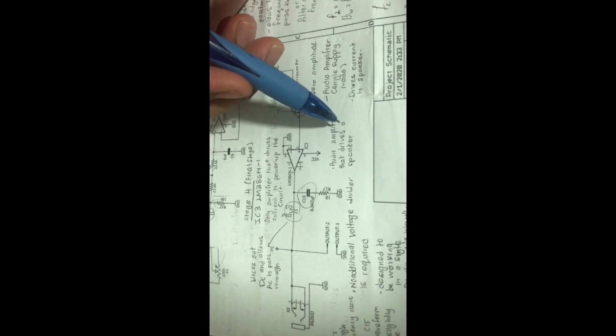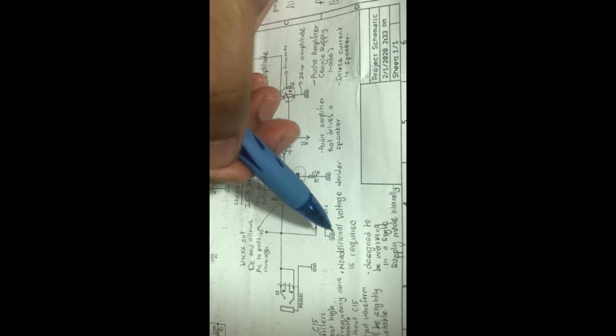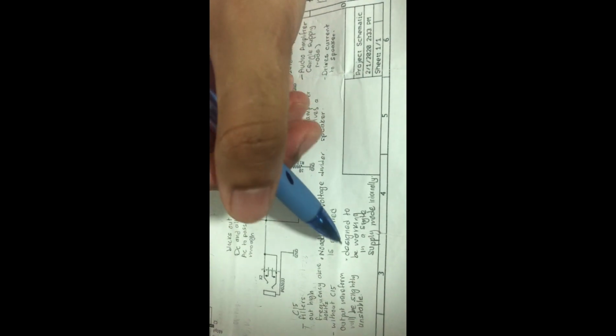Yeah. So for this stage 4, the final stage, it will be using IC3, the LM386N-1. This is the only amplifier that drives current to power up the speaker. Okay, so it's going to be an audio amplifier that drives a speaker. No additional voltage divider is required because this IC itself is designed to work in single supply mode internally. So this is an audio amplifier, by the way, as it's stated here. It's an audio amplifier with single supply mode that drives current to the speaker.